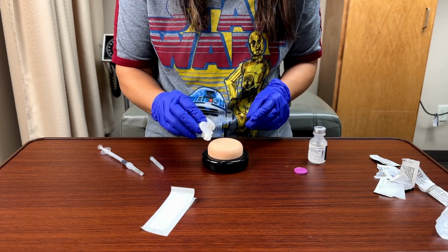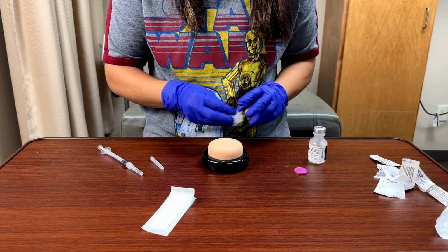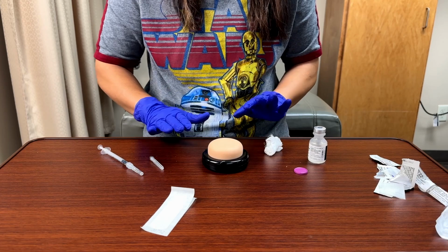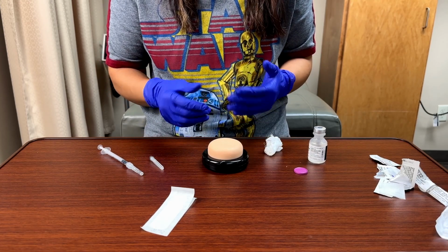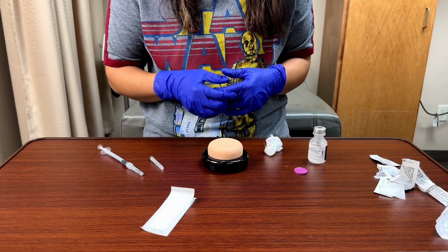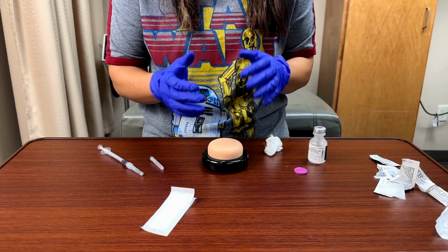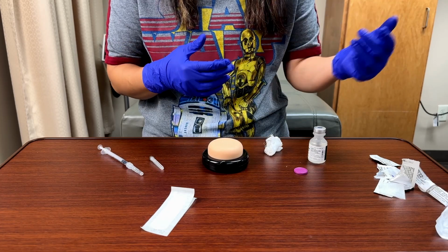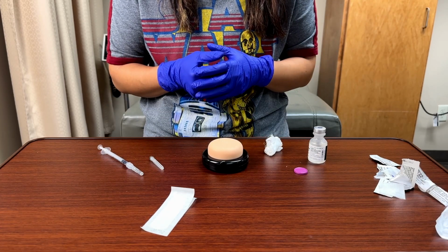Afterwards, you don't want to put a Band-Aid on this one. You want to leave it open to air and let it heal just like that. You don't want to mess with it too much. You want to instruct the patient on a test like a TB test to come back and have it read within 48 to 72 hours. Other than that, you're going to dispose of your sharps. You're going to take your gloves off, wash your hands, and explain anything to the patient that you need to explain. And that's the intradermal injection.